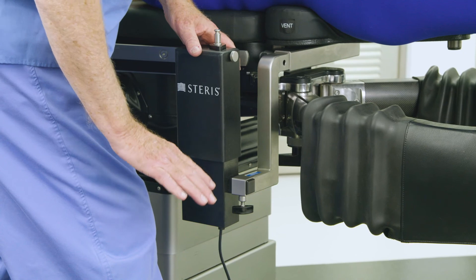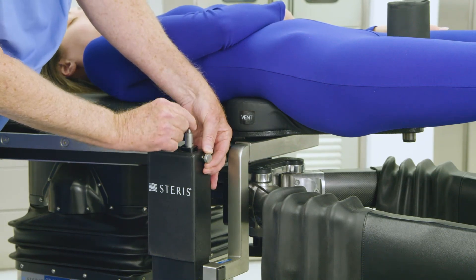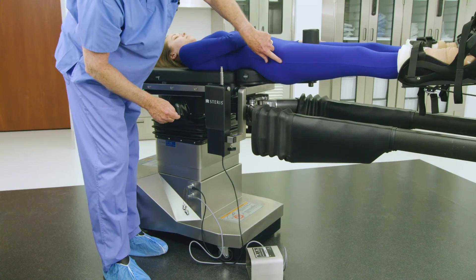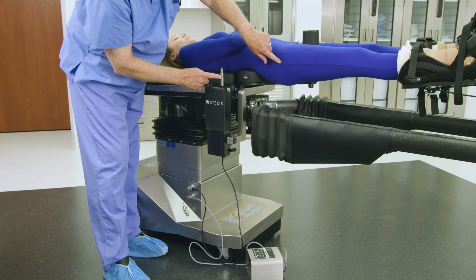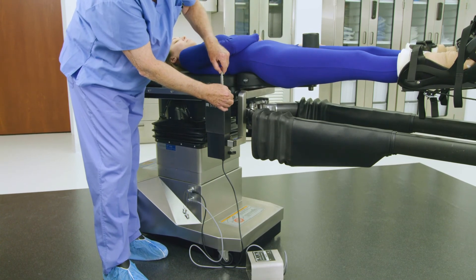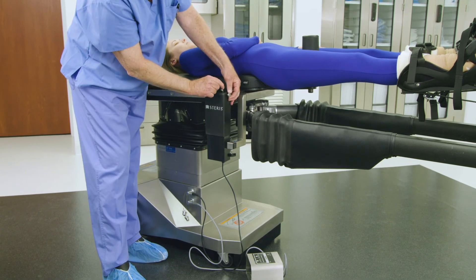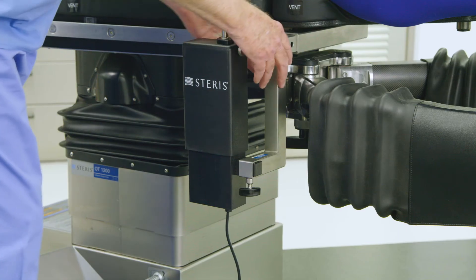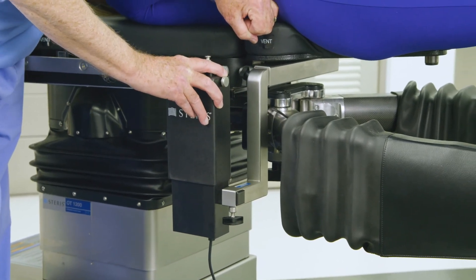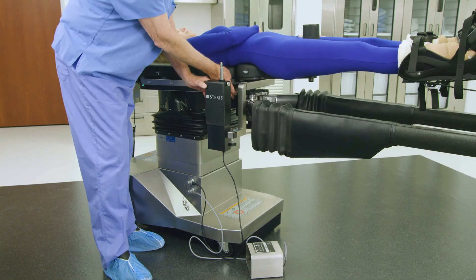Adjust the femur positioner gross height pin on the top of the femur positioner drive by pulling out the knurled knob on the side of the femur drive mechanism. Lift the gross height adjustment pin to the desired height, which is typically 2 inches below the midline of the patient's femur, and release the knurled knob so that the locking pin sits in place. Finally, adjust the distance of the femur positioner drive to the patient's hip by the width of a fist, and tighten the knob on the table attachment to lock the S-bracket in place.